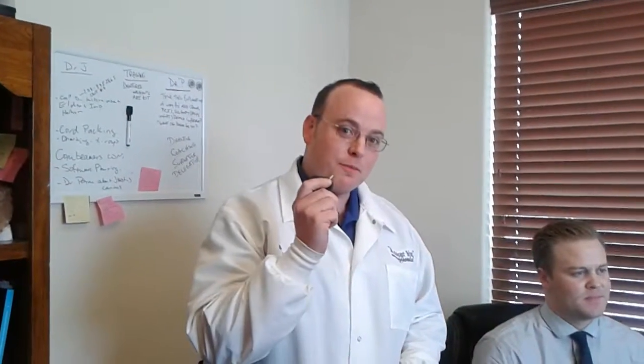Brian Howley with Epic Loops showing you how to take an accurate working distance measurement using a simple tape measure.